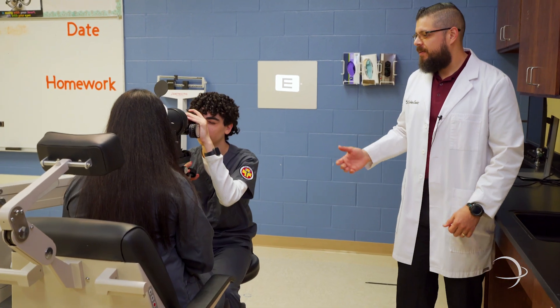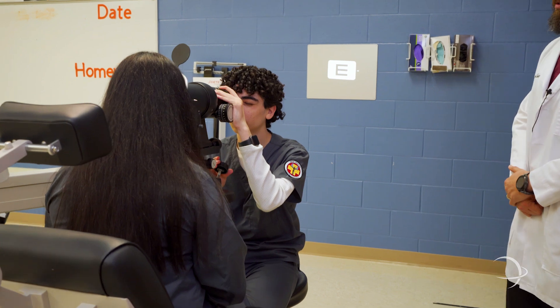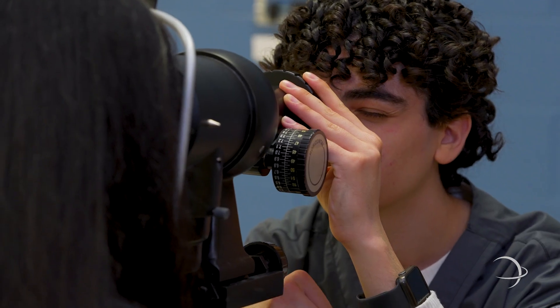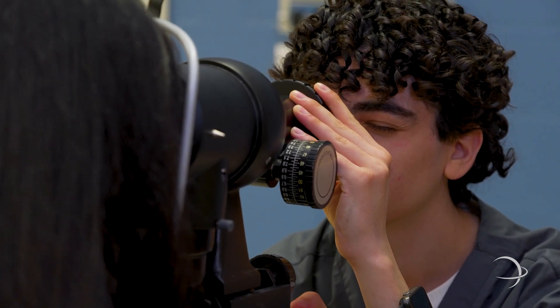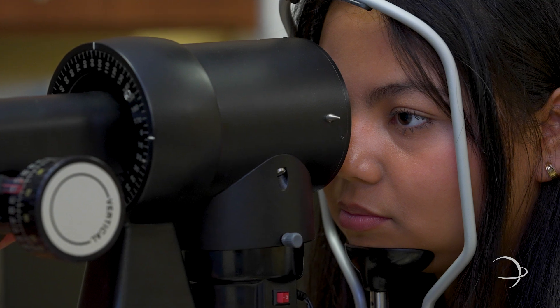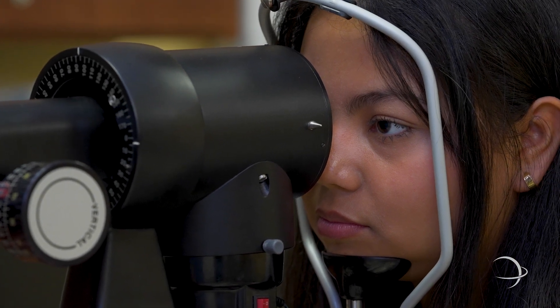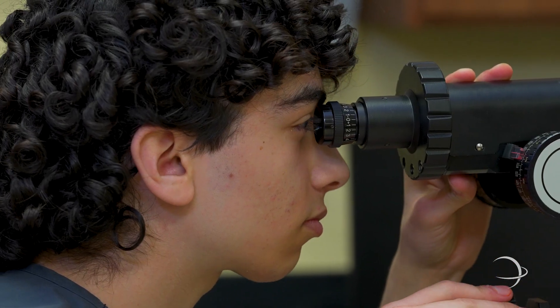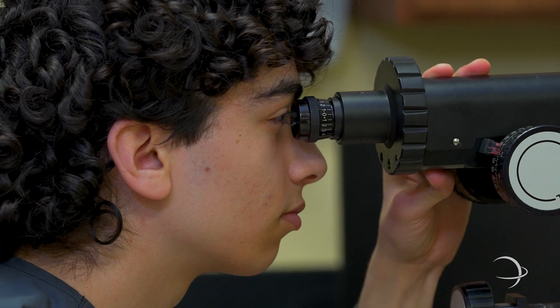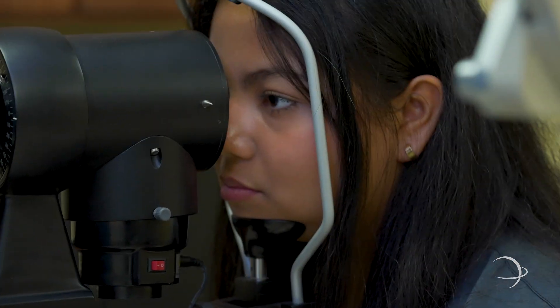To the right, we have a keratometer. The keratometer is meant to measure the curvature of the cornea. This is going to allow us to determine the refractive error — in other words, get the prescription for people who want contact lenses. In this case, Hashim is using the up-and-down knob and adjusting the horizontal and vertical view.